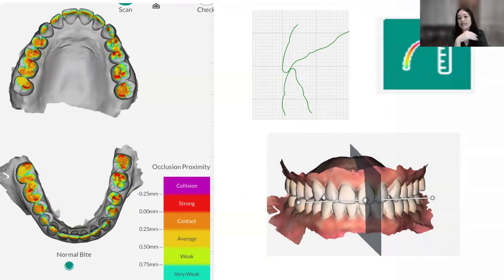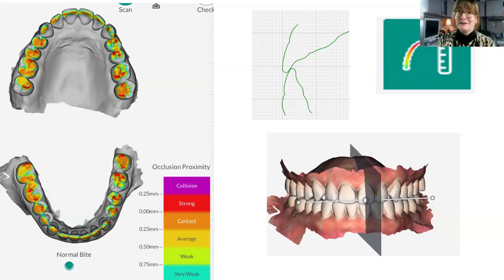So back in the days, Kelly, I was so envious of a lot of the dental assistants that took amazing photography, right? We would get training. We sent them to classes and they would learn how to retract, pull the lips out, take a picture with your camera. I had the Lester Dine camera in our office. And we would schedule 30 to 45 minutes chairside time to take these pictures, load them in, crop them up, and voila, we would turn them around and show our patients.